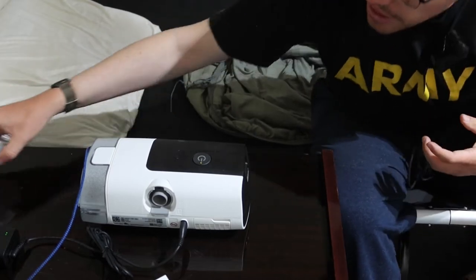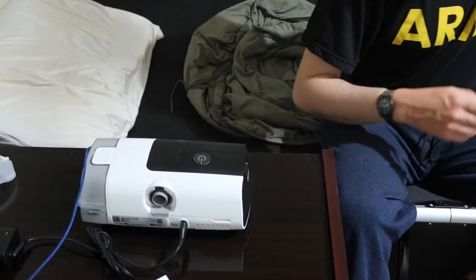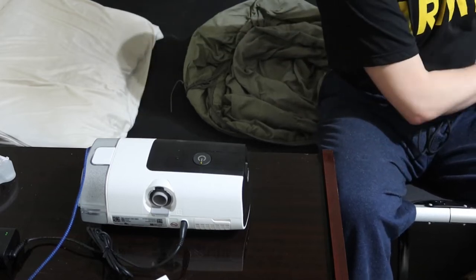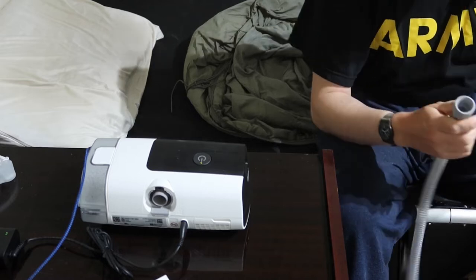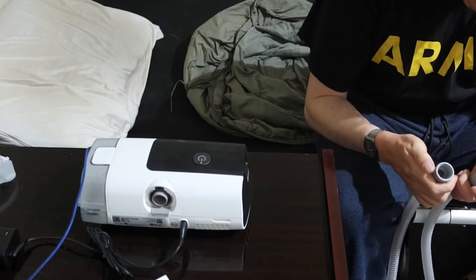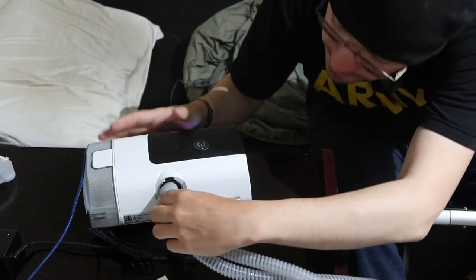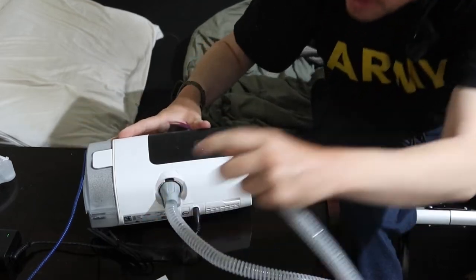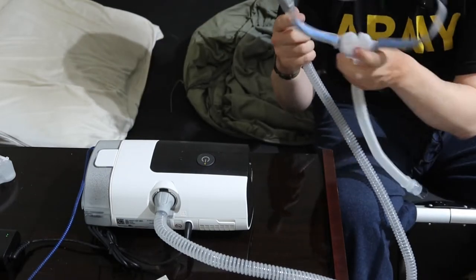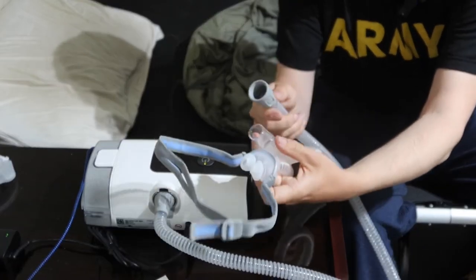Now I'm going to hook up the more uncomfortable mask first. You wash the mask once a week — a minimum of once every other week, but I'm going to clean mine once a week. It's as simple as plugging one end into the machine and one end into your adapter.